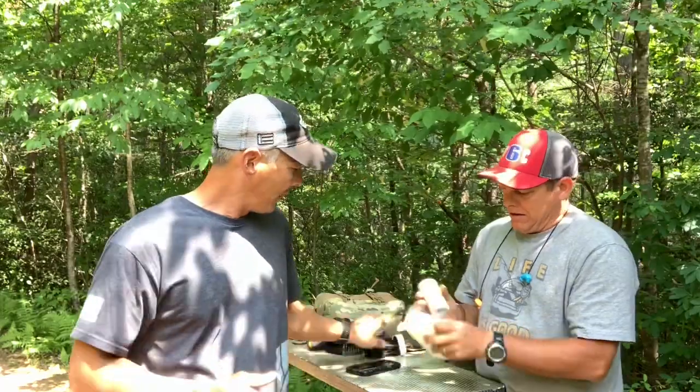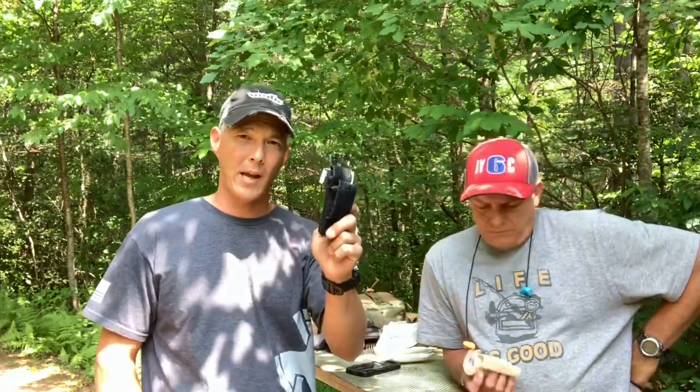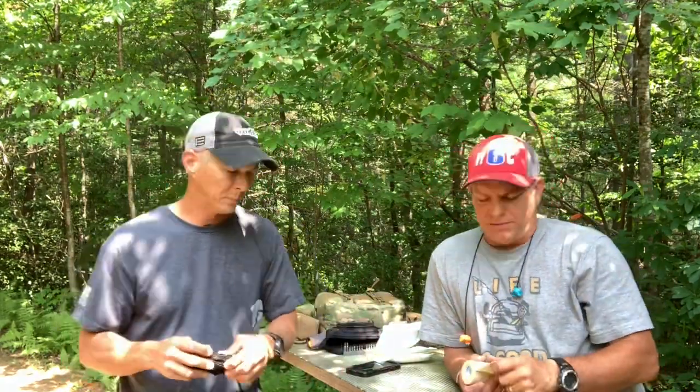Hey guys, and this was completely impromptu. What started this is we were out here shooting, and I was like, hey, what do you keep in your bag? Because he always knows that I carry the CAT on me, always. Be careful because there are a lot of knockoffs of the CAT. They'll have the CAT name and everything else. I think they're made in China. There's some that are steel, and there's some that are a heavy polymer. They both work well, but you will see a few variations.